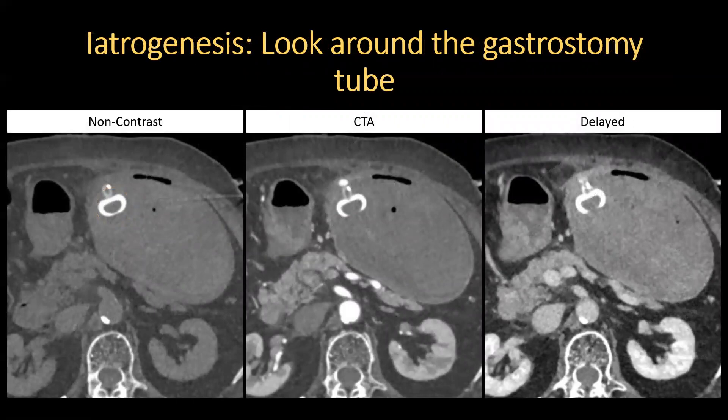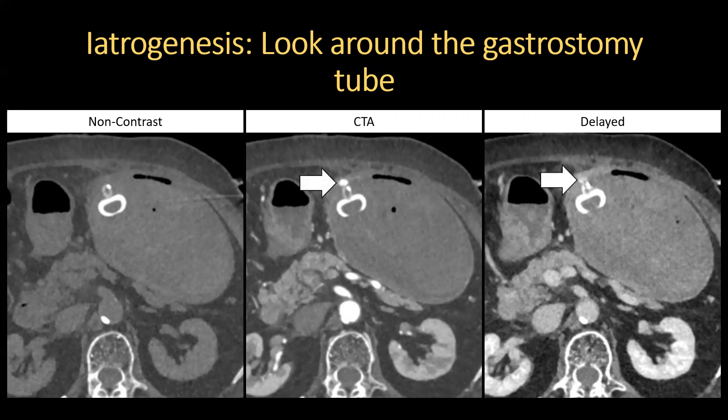This bleed was detected, but again highlights the importance of looking around the site of a newly placed line or tube. An 86-year-old female became hypotensive after recent gastrostomy tube placement. On non-contrast images, the stomach is distended with hyperattenuating contents. Arterial and delayed phases show contrast extravasation along the gastric wall at the gastrostomy site.